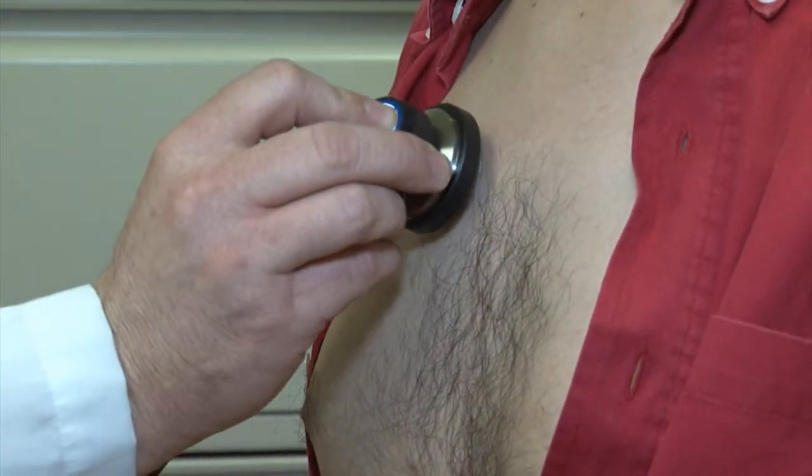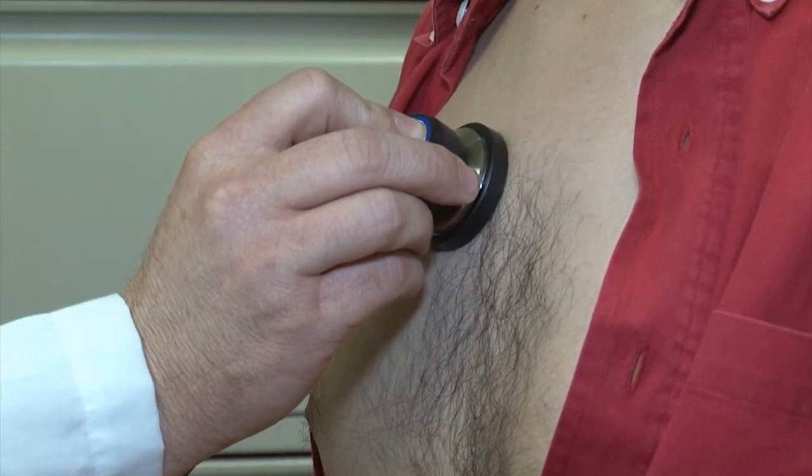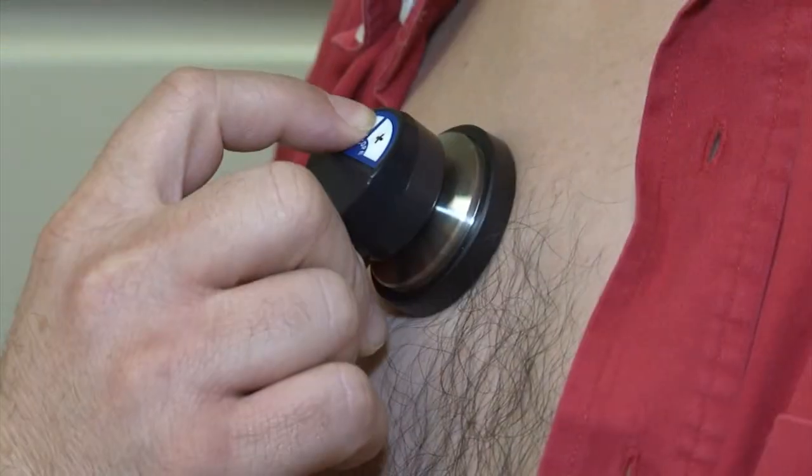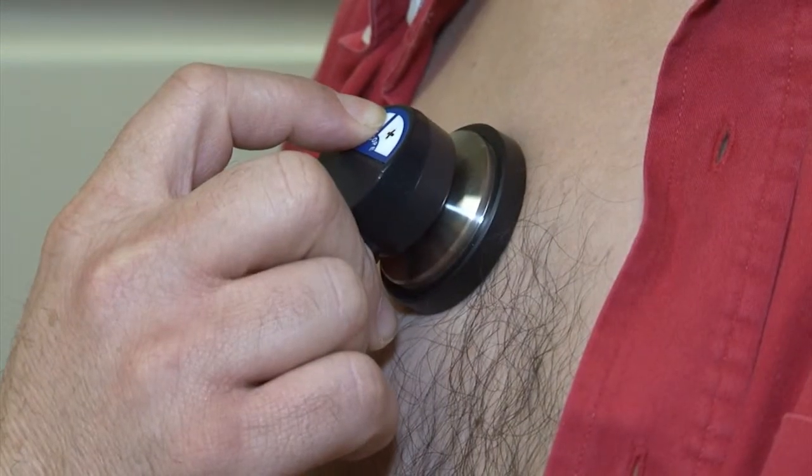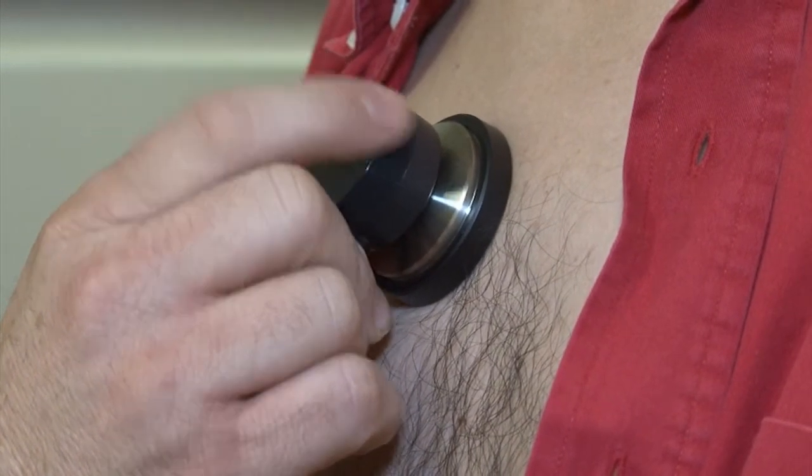Place the chest piece over a patch to hear sound assigned to that site. The volume can be adjusted up or down while the sound is playing.